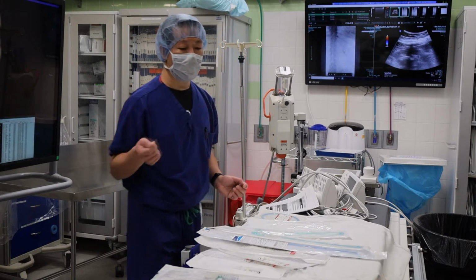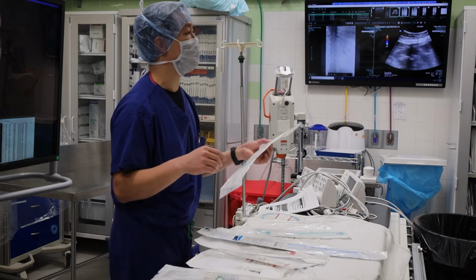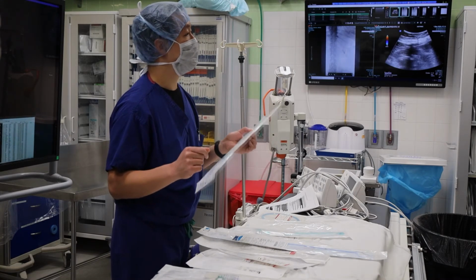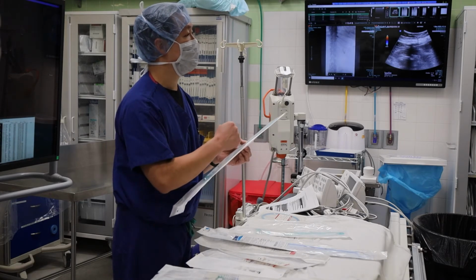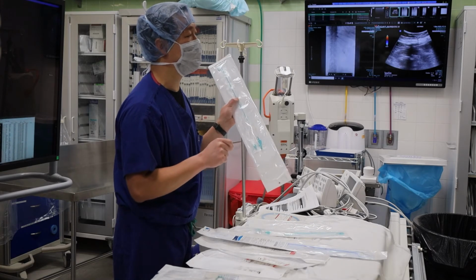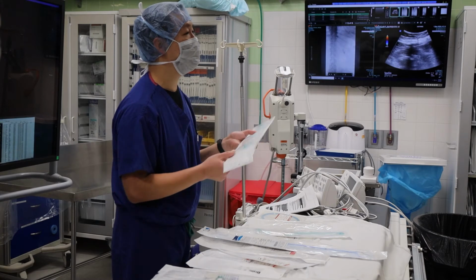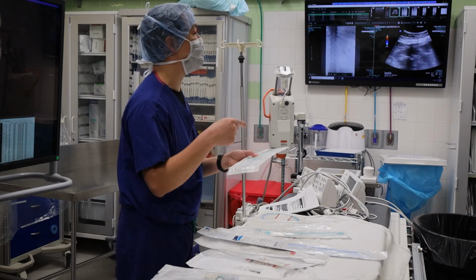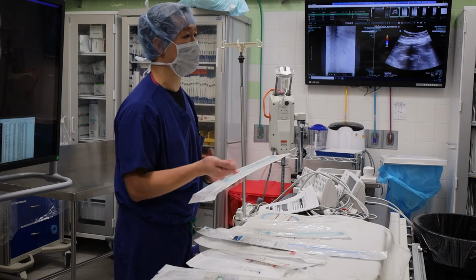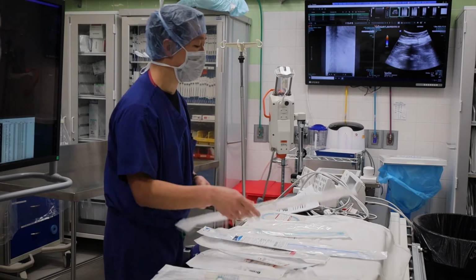As for suture on the outside, if you put in an 8 French tube, it's hard to sew and secure an 8 French tube. If you use a non-braided permanent suture, oftentimes you have to tighten it enough to just barely cinch down or almost kink the tube a little bit. An 8 French tube loves to be occluded. So sometimes you see us actually putting the stiffener back in it when we sew down on it for that purpose, or we use silk, because silk, for the same amount of tension, grips a lot more than monofilament.